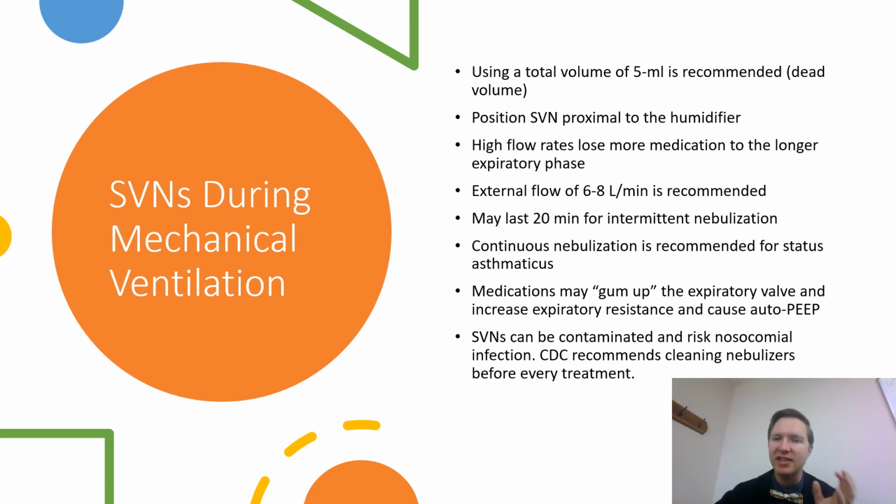But that dead volume might not be delivered. So by adding extra volume to that nebulizer, less medication will actually be left over. Because you're diluting it, less concentrated medication will be left over. So if anything, put more than 3 mLs in there, put closer to 5 mLs, and that will help make sure the patient gets most of that medication.